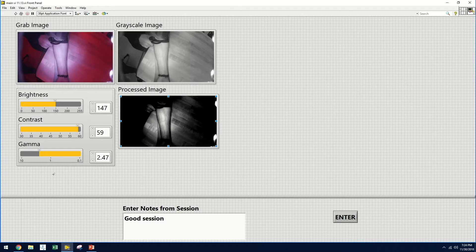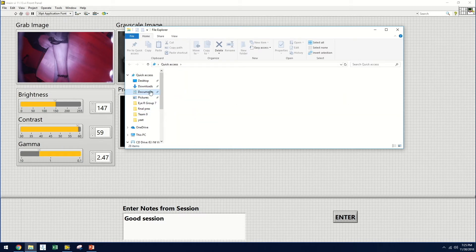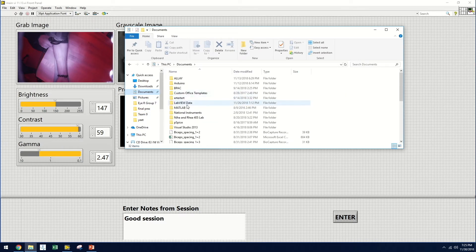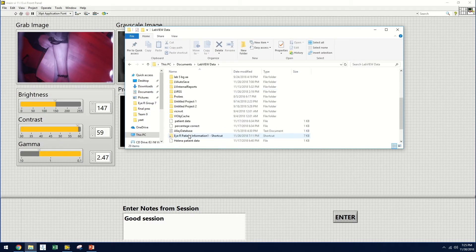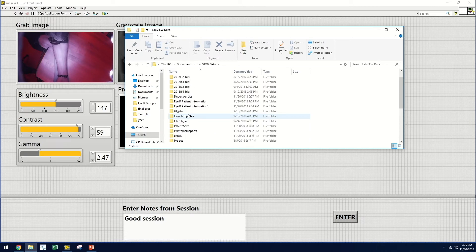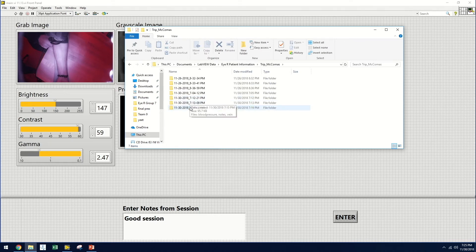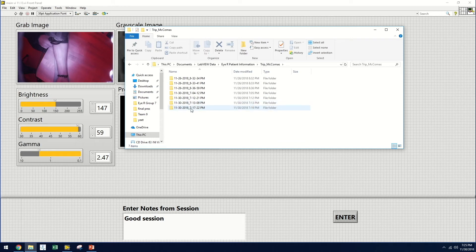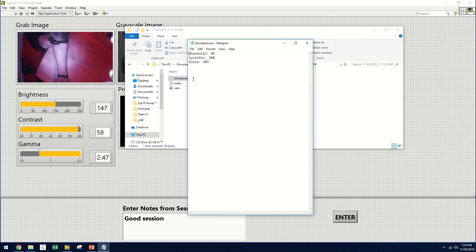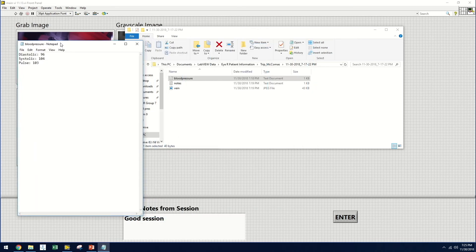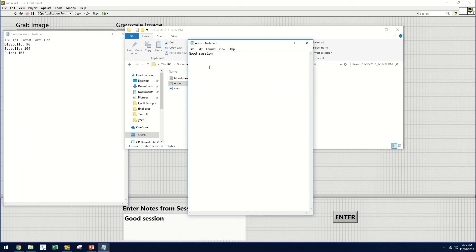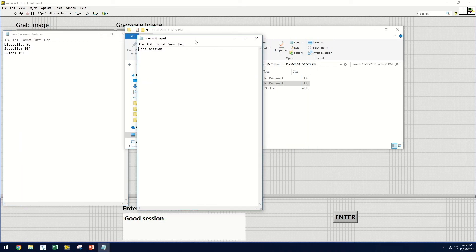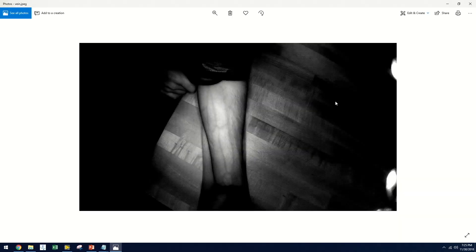So now let's take a look at the patient profiles. We will access LabVIEW's default data directory and select a folder called IR Patient Information. This will show us all of the patient profiles. We will select the correct patient and the correct day and time of the visit. And within this folder, we will see files for blood pressure, the notes from the session, and the successful vein image.